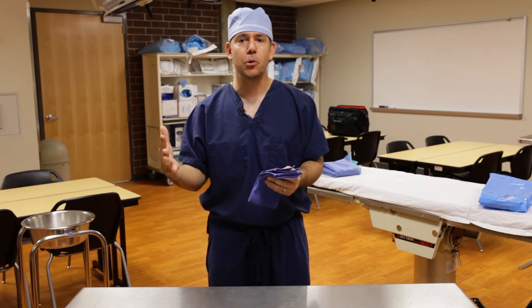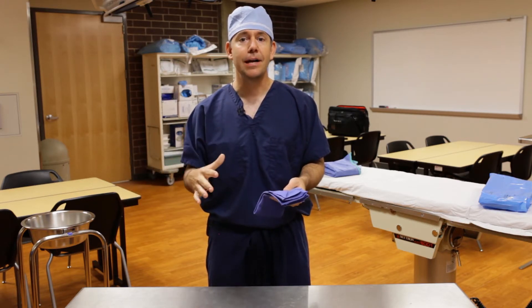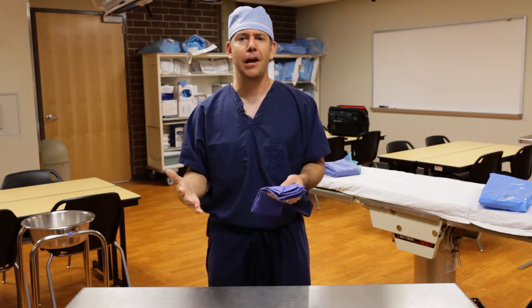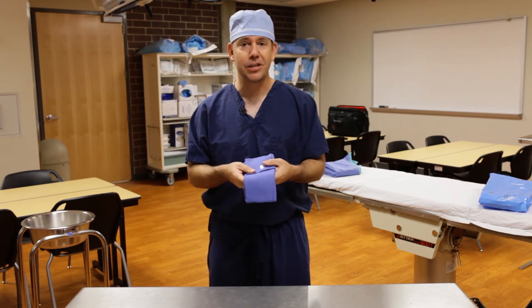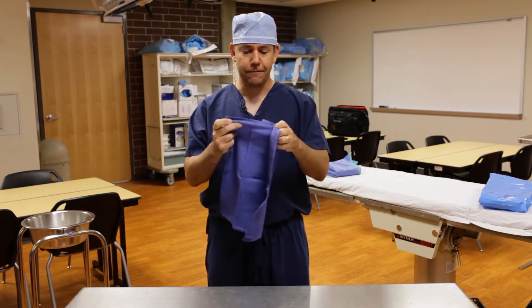Normally in the operating room, we're going to scrub our hands, come into the operating room, and the next step is to grab a surgical towel. Since we want that first time, every time experience, we want to make sure we refold our towel properly every single time. So here I have a standard blue surgical towel, and I'm going to completely unfold it.